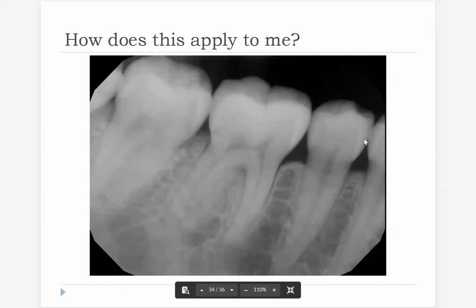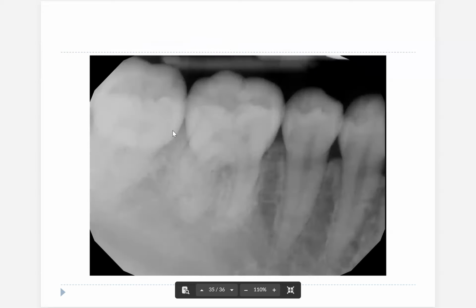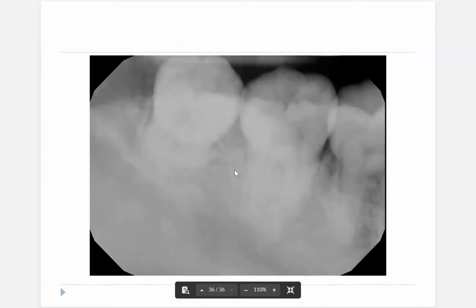We see our contacts are decent, but the apices are kind of missing. And we definitely don't see that third molar. So we take another picture, we change the angle, and we get a little bit farther back, but we're still missing a huge amount of information back here. And we're getting some more foreshortening and distortion, but we really want to figure out how do we get back here more without having to shove our sensor all the way down our patient's throat.